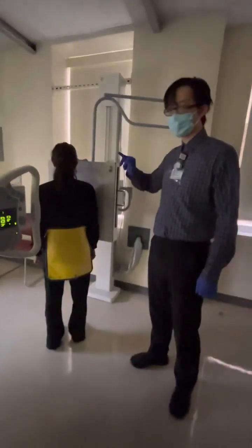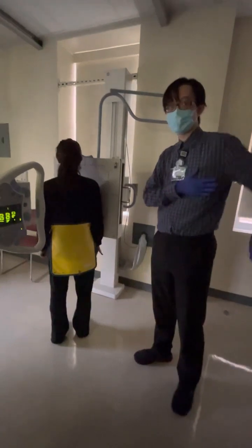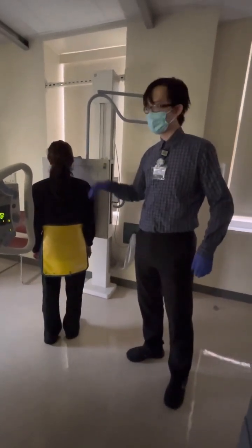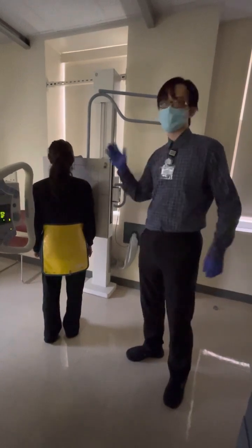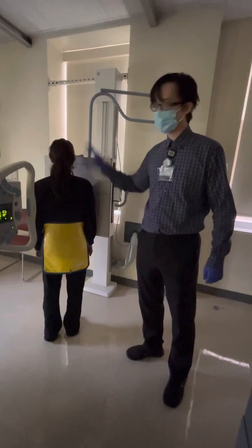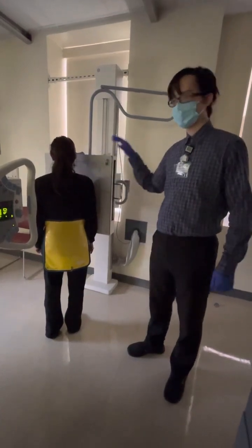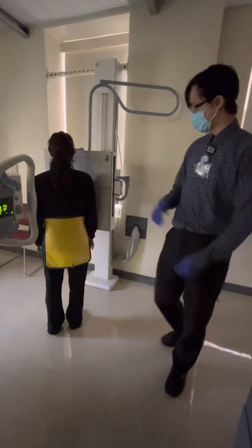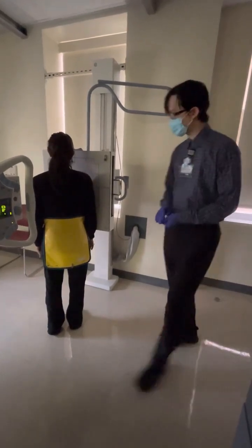So it's the side closest to the IR in terms of anterior versus posterior. It's not about left and right. It's about, is the anterior closer or the posterior closer? Anterior is closer, so this is more for the left anterior ribs. Left anterior and left side, right? Left axillary ribs. Good. All right.